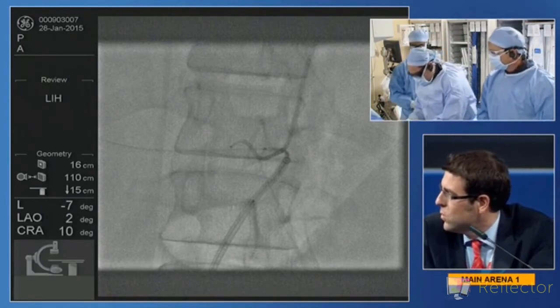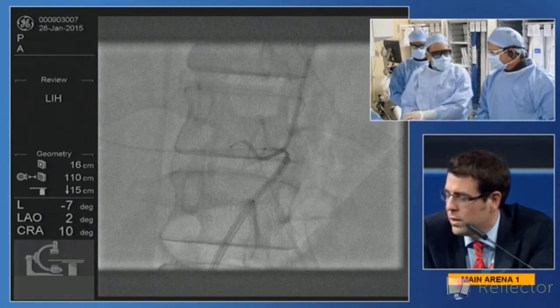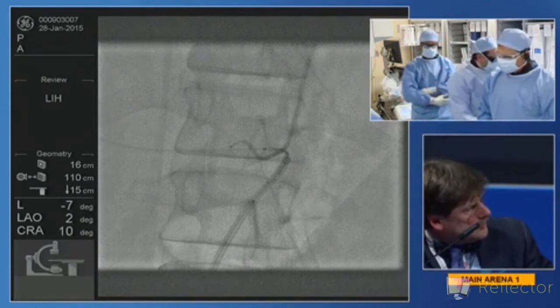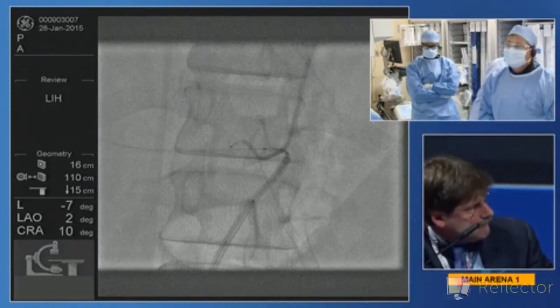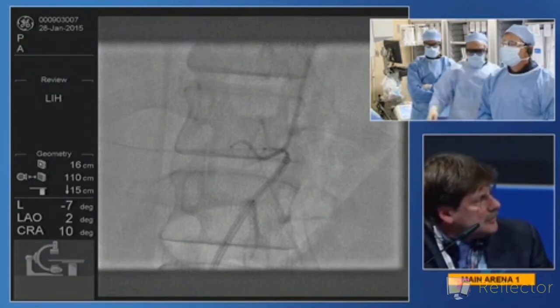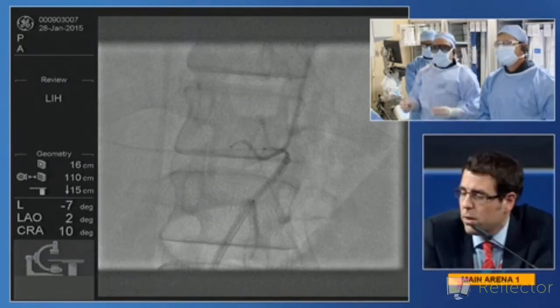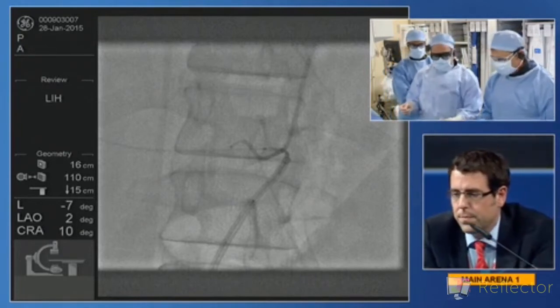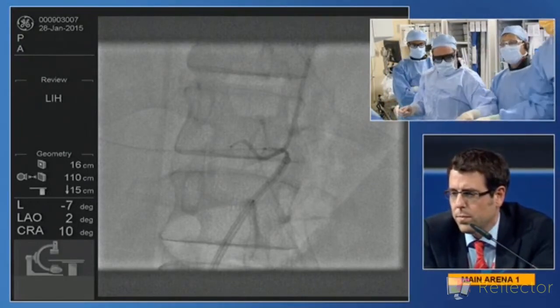Do you take an 014 wire deep out there, or do you take a 035? 035 should be okay, I think, for fast. Glide wire. Glide wire, we'll be good to go. So once you do that, I get the micro in place and deploy. I'm hoping we'll get this done in the next 4 minutes.